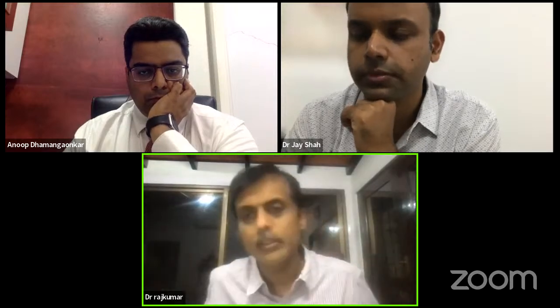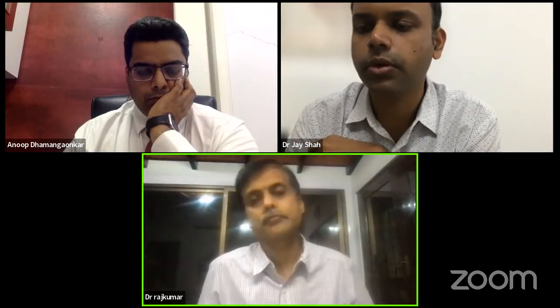Because you need to lateralize. So the cup will sit very nicely in your anteroposterior column. So that way, uncemented should be the first choice. I will always prefer an uncemented cup.